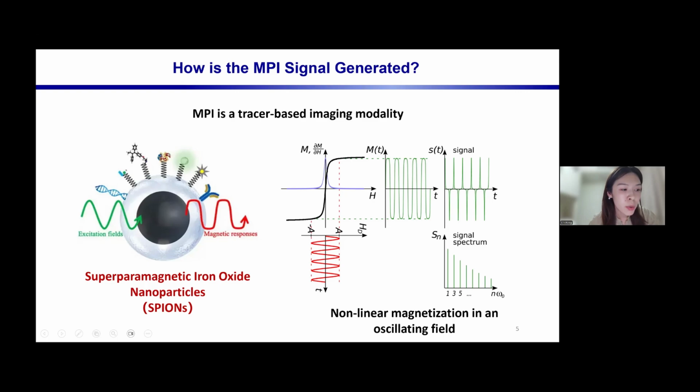And what's really cool is also how versatile these nanoparticles are. We can just use the plain particles, and we can do things like blood flow imaging, or brain perfusion imaging, or cell tracking.